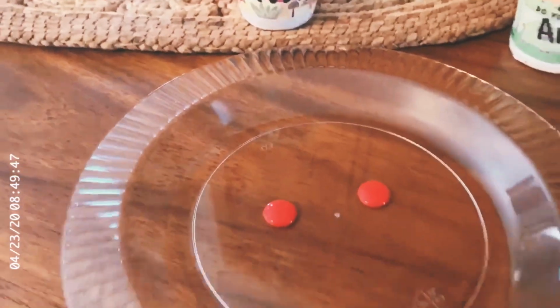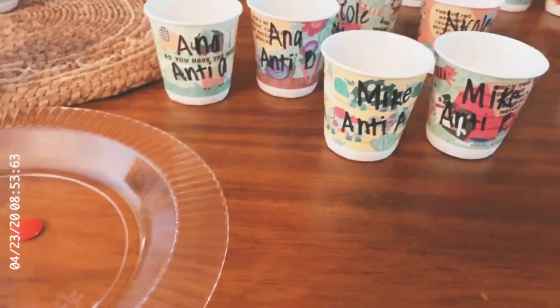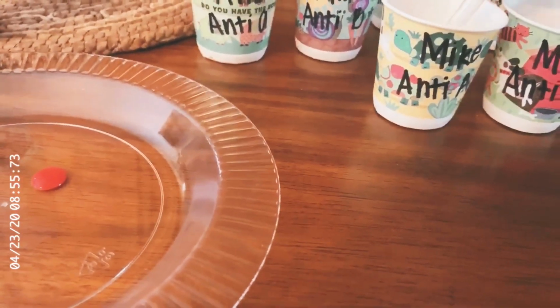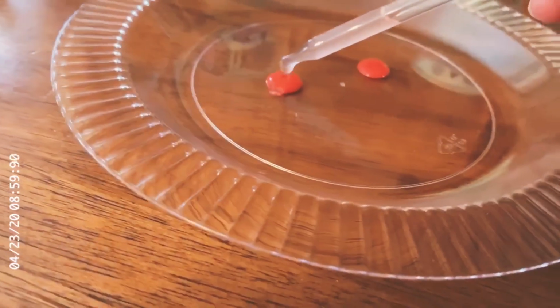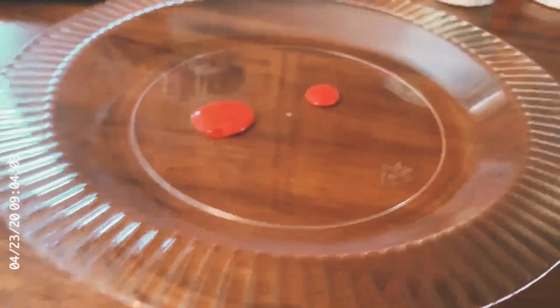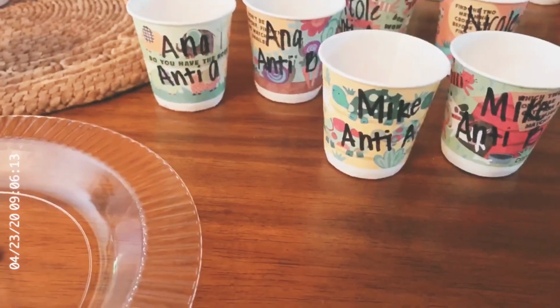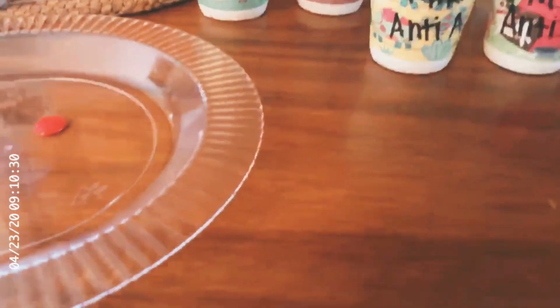Where is he? Right here. Here's his B. Here's his A. So I'm going to take a little bit of anti-serum A and I'm going to put it on the first drop. Whoops. I'm going to try to put it in the drop would be good. Okay. Got to clean my pipette. And then I'm going to go ahead, or my dropper, I guess. It's not even really a pipette.